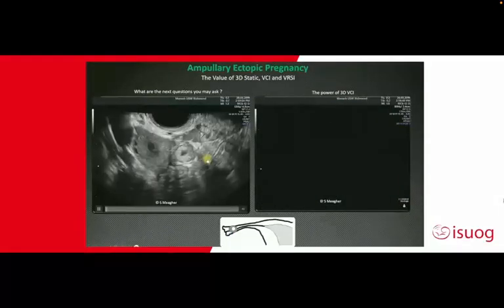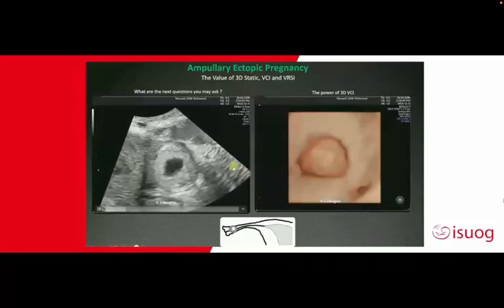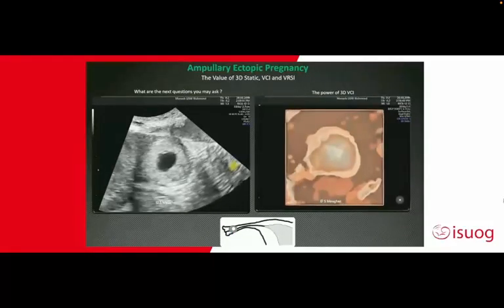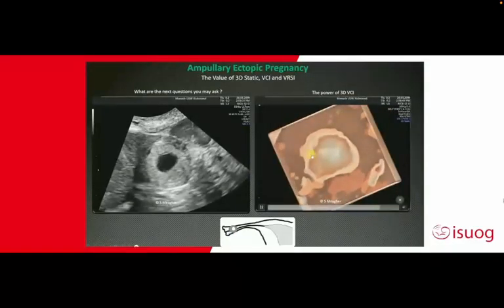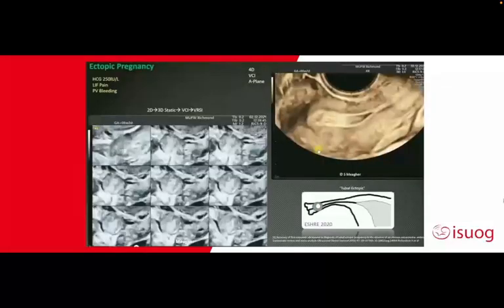This takes a volume of the ectopic pregnancy and demonstrates the internal echotexture of the gestation sac. When we rotate around the y-axis, we can see it's not actually spherical, but rather a disc-like structure. Not surprising, considering it is compressed by the fallopian tube.